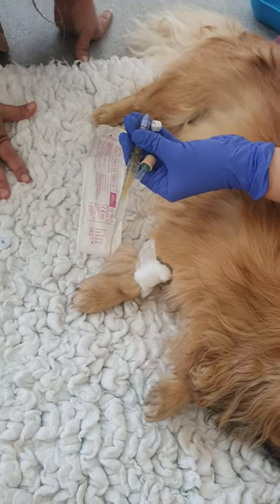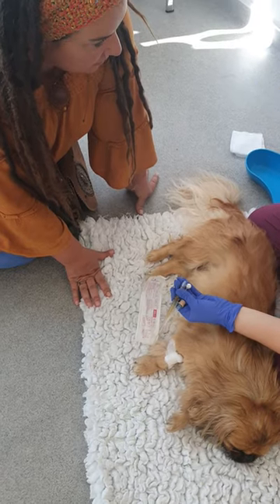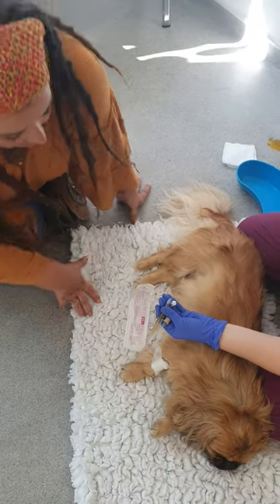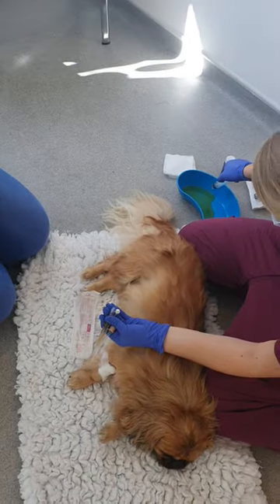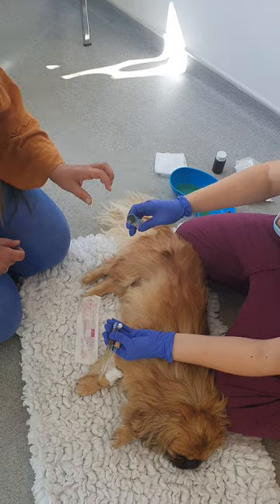How do you know how much to take then? Once the resistance builds up and no more urine is coming out, then you can just pop it in there. Just get like a little bit of a bottle.